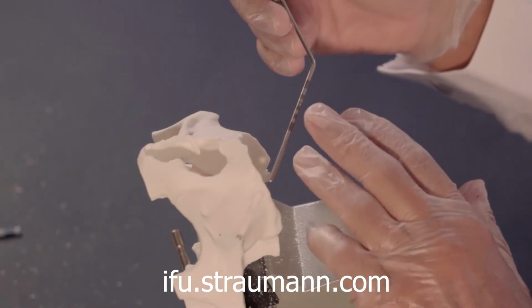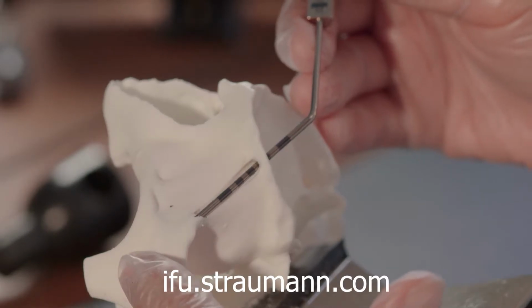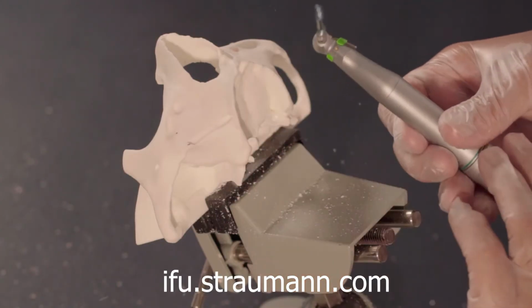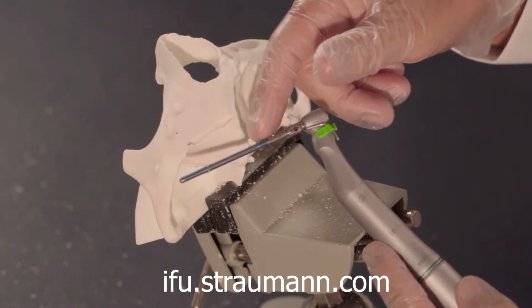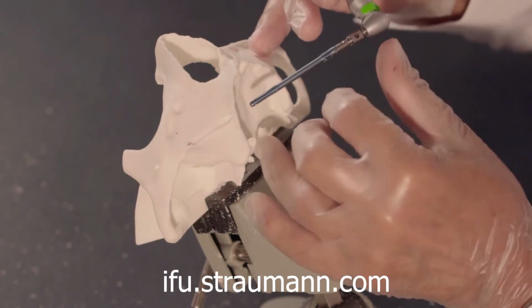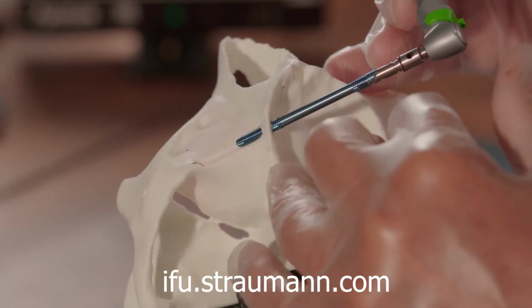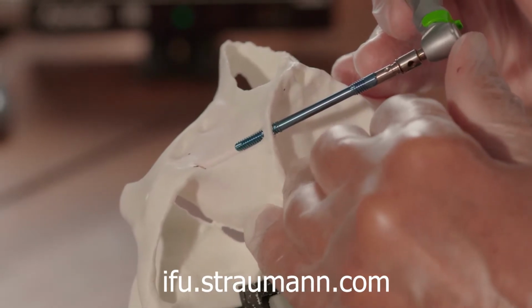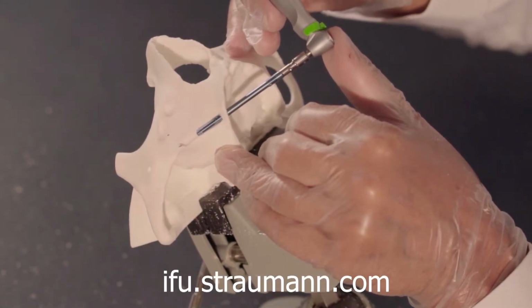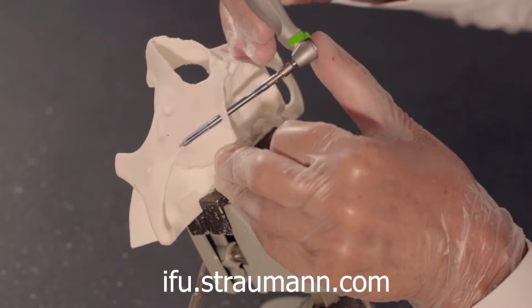So now our next step is to measure how long our implant is going to be, how long our perforation has been. We will introduce this gauge until we get this part. You see, I like this kind of implant mount, which is very narrow. It's not going to disturb you. Of course, we change our speed. And you see now the first part of the implant is free until this upper part, which goes to 3.9. The osteotomy is very precise. I'm pushing here, but still I feel some resistance until the upper part.